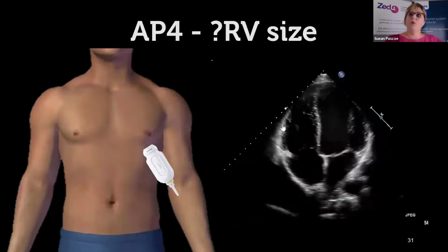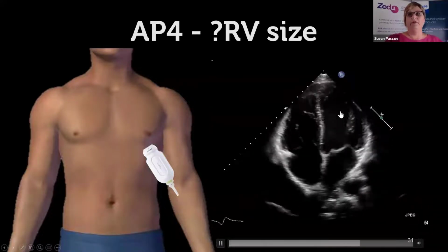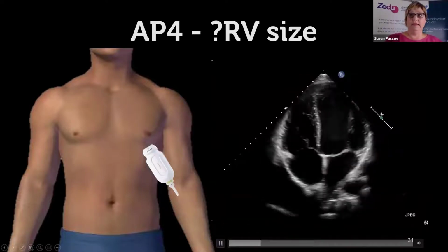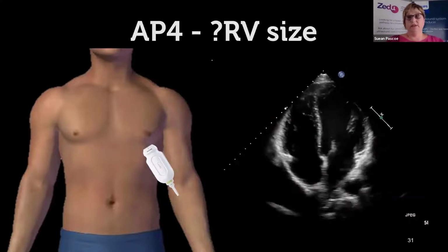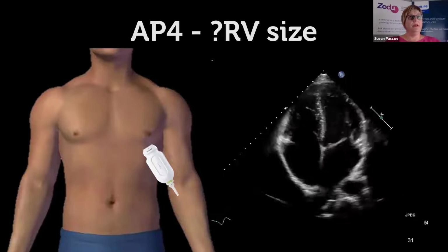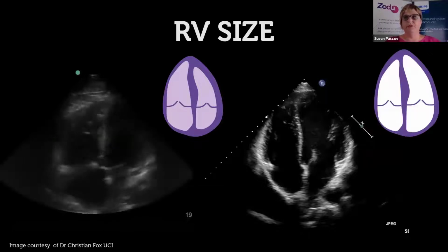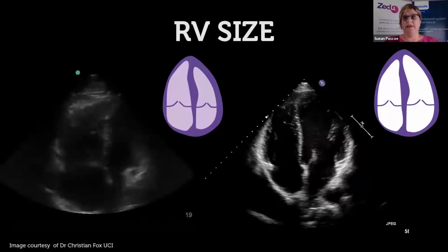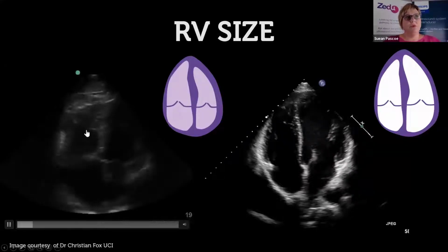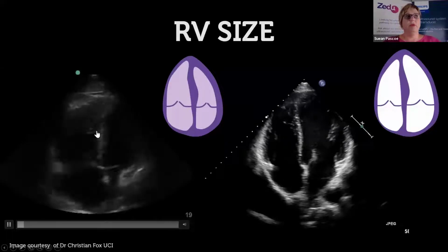Now, when we're looking at the normal right ventricular size, the RV should be about 1/3 to 2/3 of the LV. So when you have an enlarged right ventricle, those sizes and proportions get mixed up. You can see here on the left we have a very large right ventricle. And so then the question is, how do I know which is right and left? In this view, the right ventricle has the moderator band. The left ventricle doesn't have a moderator band. So you look for the moderator band, and that definitely tells you it's the right ventricle.